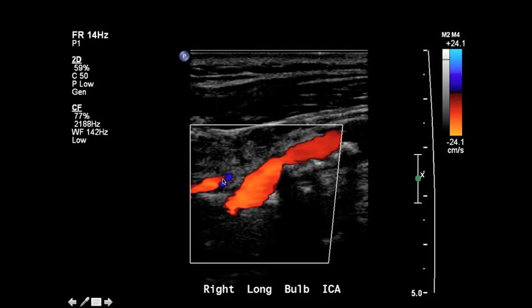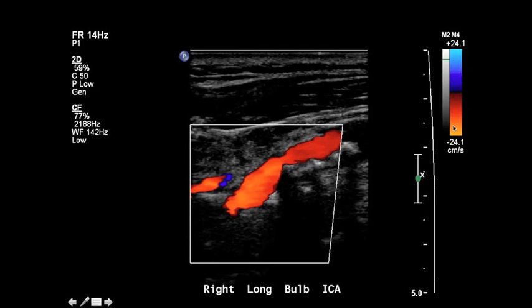You can see there's a little bit of a venous signal here. This is coming back from the patient's head towards their feet, coming towards the slant of the transducer, so that's going to be listed here in blue. The relative color values are assigned to the image based on the velocity of flow within it.